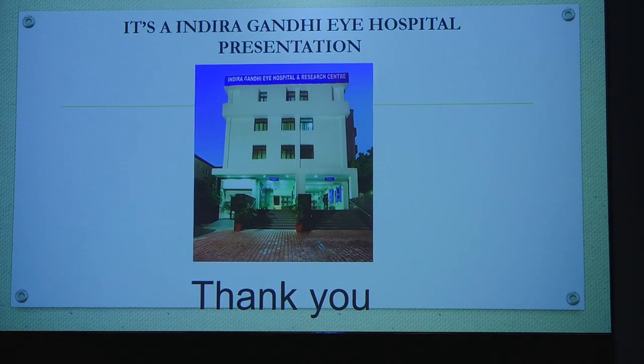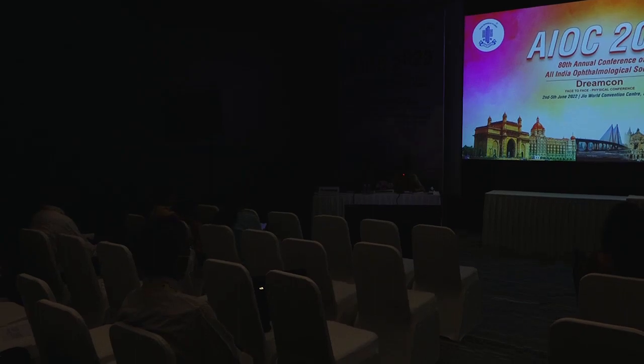Thank you very much. Thank you, Shweta, for such a nice talk. The questions we will take in the end. The take-home message that I would like to pass here is, though she has elaborated a lot on the plateau iris and how imaging plays a role, gonioscopy is the gold standard. All the patients should have a dynamic gonioscopy also. That cannot be done with anterior segment imaging. You can see the pigments and blood vessels using gonioscopy. And it should be repeated if the patient has undergone any procedure, or maybe yearly. An occludable angle can be occluded after 1 year, 2 years. So yearly repetition of gonioscopy.